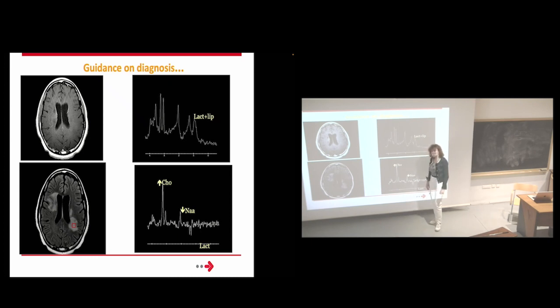I understand the spatial resolution of the image. But when you do spectroscopy, usually you do this at a pixel which is much bigger than the spatial resolution because you need to average a little bit. And what is the compromise? The compromise, in fact, is really in correlation with the time to spend in the machine. So I cannot really answer that. That depends. But of course, the better resolution you want, the longer you have to stay in the machine.